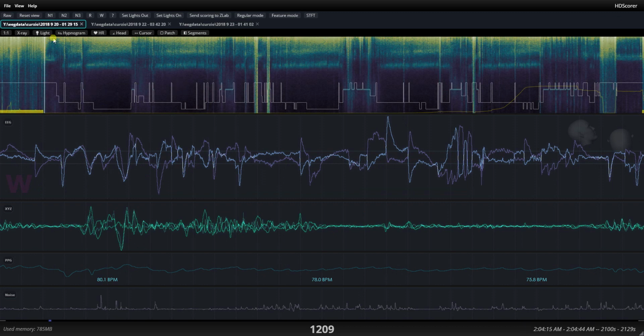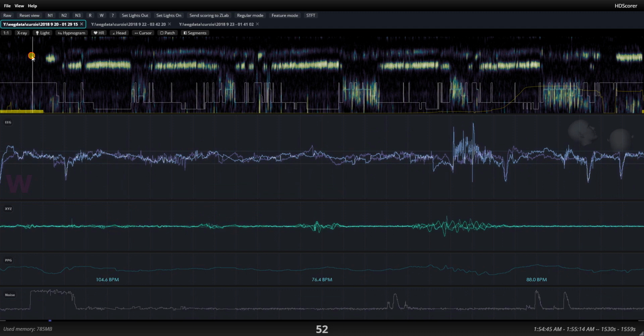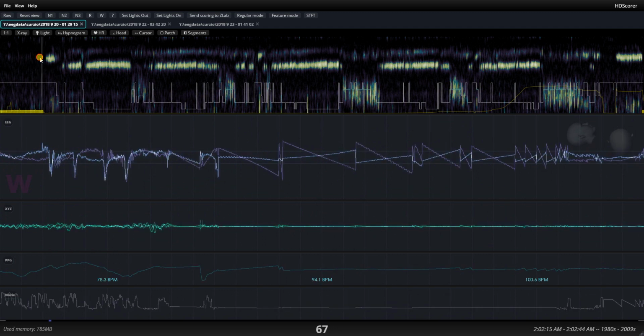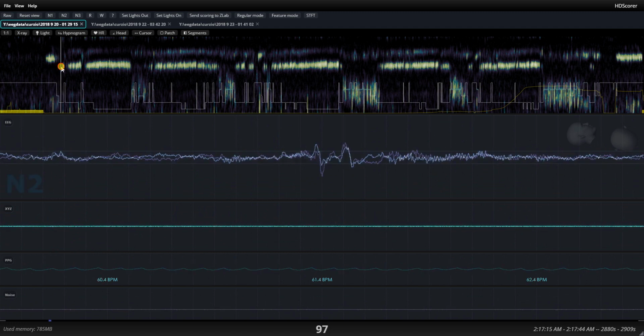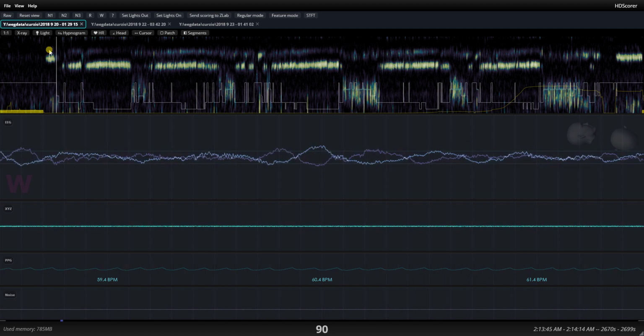Anyway, so as you know, there's two ways to look at the spectrogram. We go to the X-ray because it highlights things much better. The first thing that I look at when I want to figure out if the scoring was correct is the sleep onset. This is an initial chunk of alpha activity, which appears after a period of just settling down and walking around. You see a lot of movement, a lot of awake type, fast eye movements, probably reading. And then there's a gap here before the spindles begin. So actually this onset determination is perfect. This is exactly where I would have ended the alpha activity, that is wake.